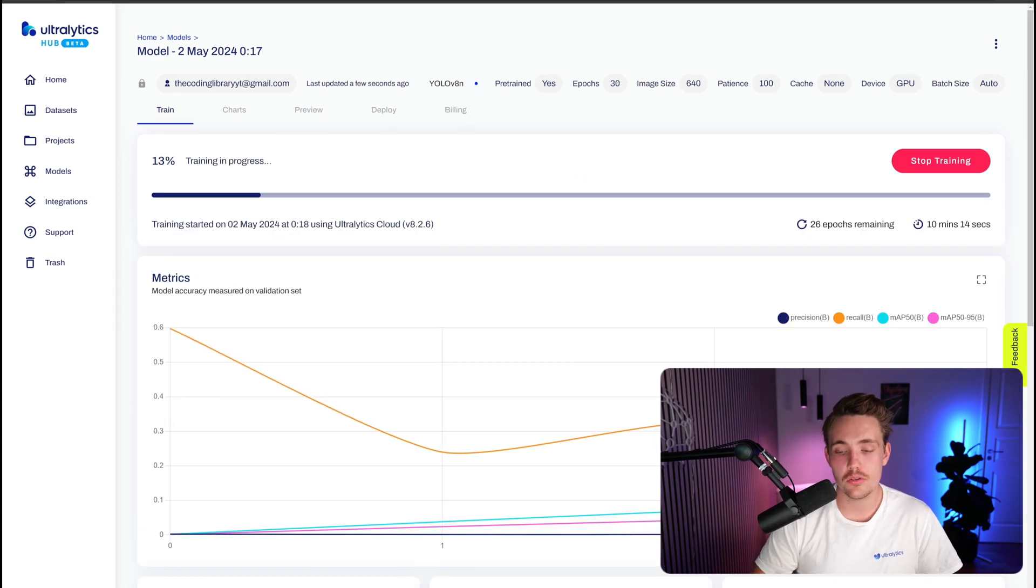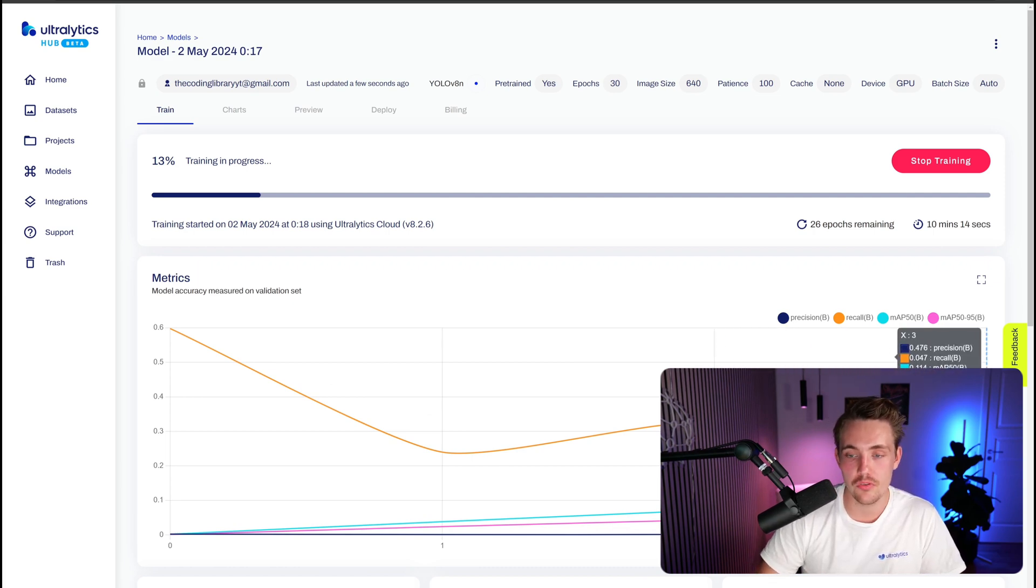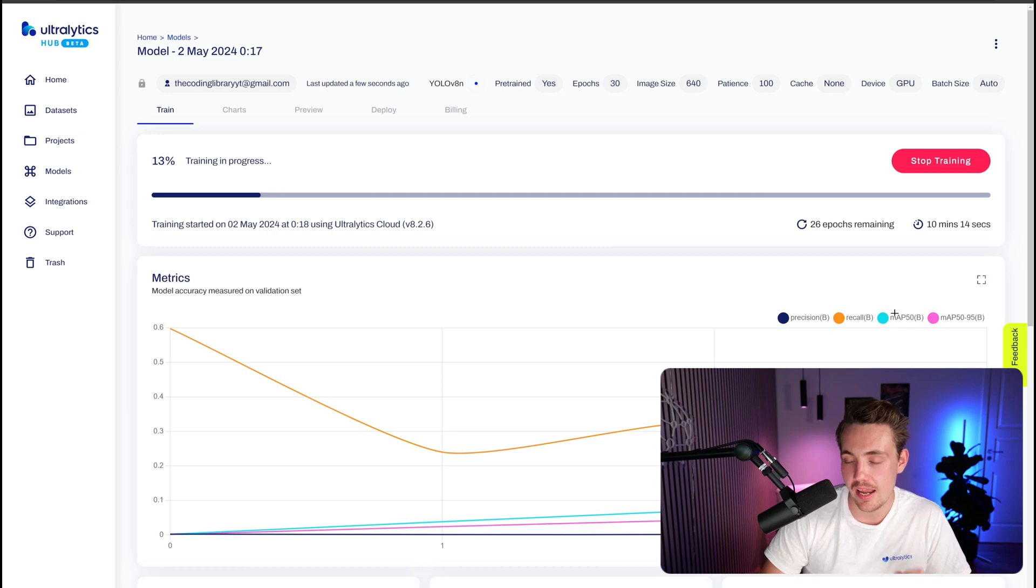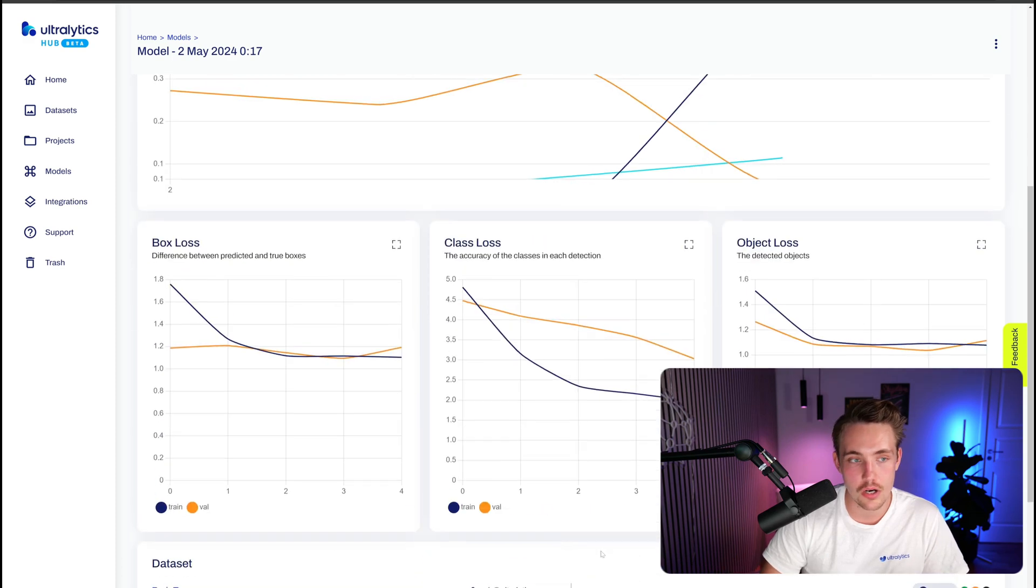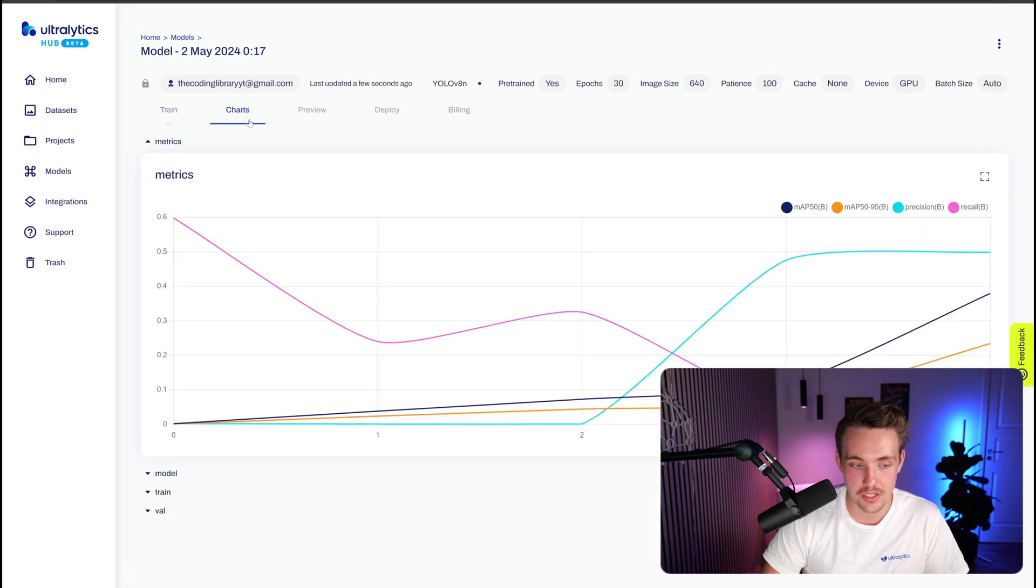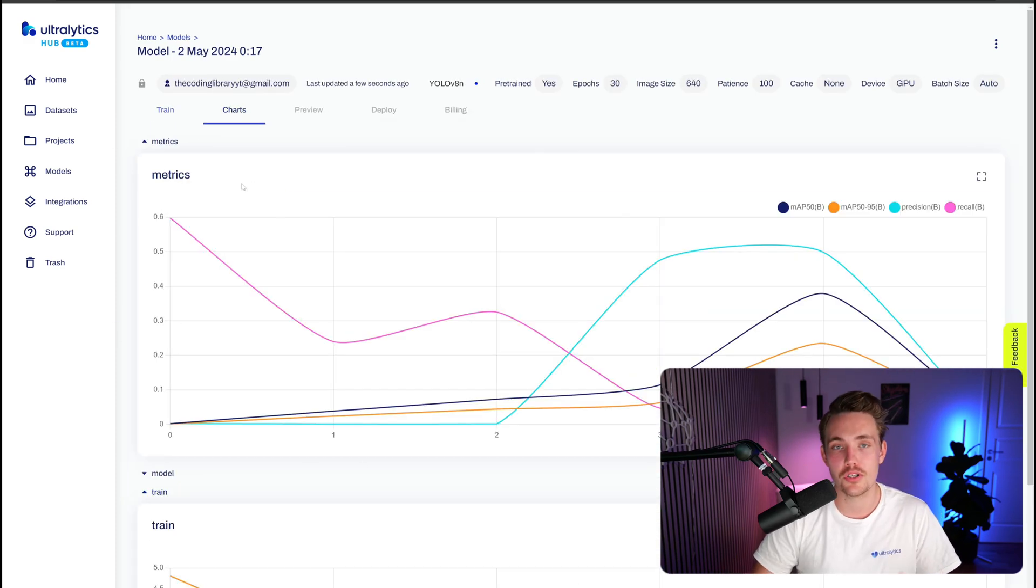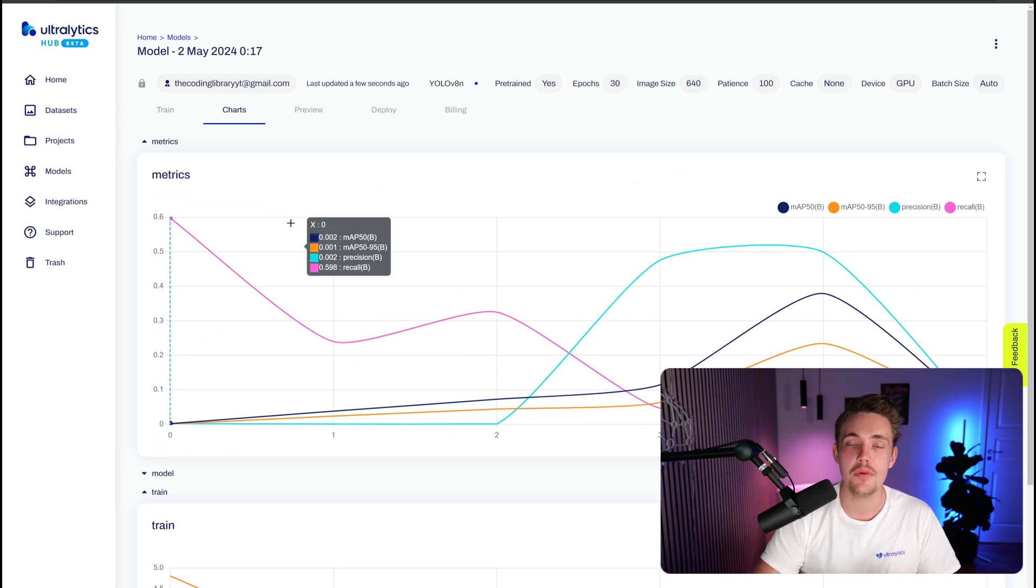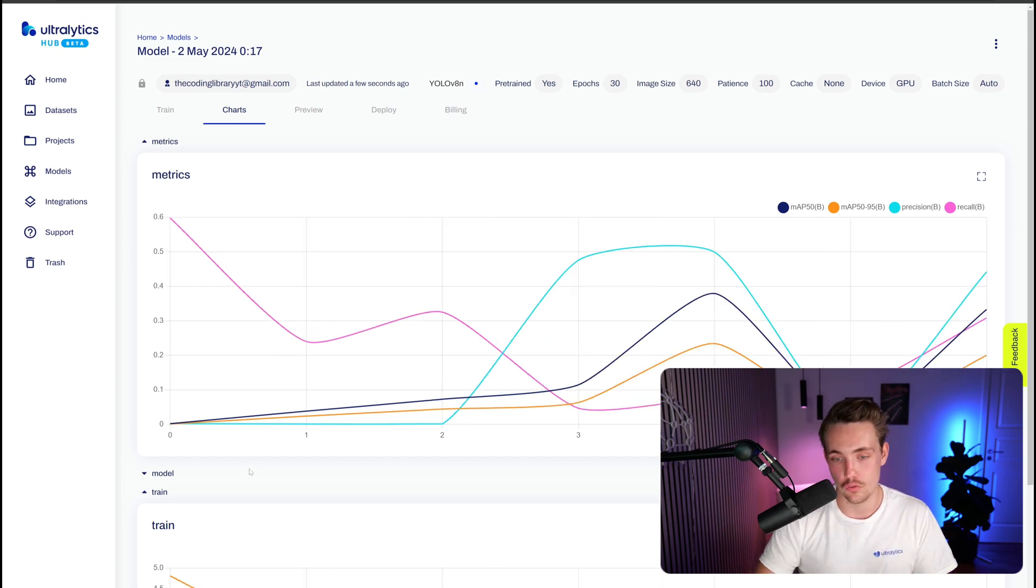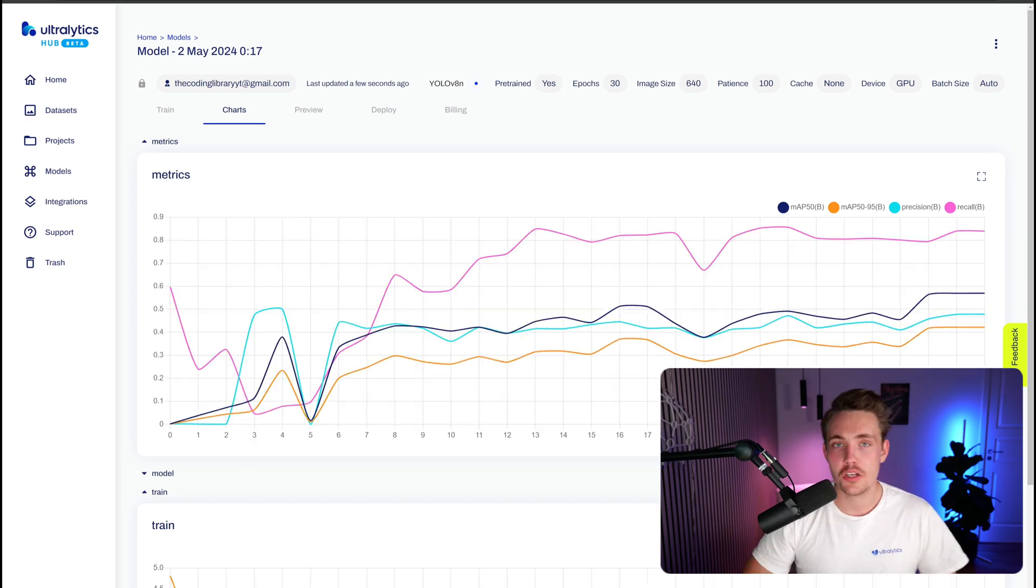Our model has now started training. We can see all the metrics live epoch per epoch, both the precision, recall, mean average precision, and those metrics. If we scroll a bit further down, we can also see the losses, dataset overview and so on. After that is the train, we can go inside the chart and see the train and validation graphs as well. It's pretty cool that we can track our metrics live, and we want our mean average precision and precision recall to go up over time and converge at the end. Then we want our losses to decrease over time. Let's just let it run here for 30 epochs and let's get back and take a look at the results.